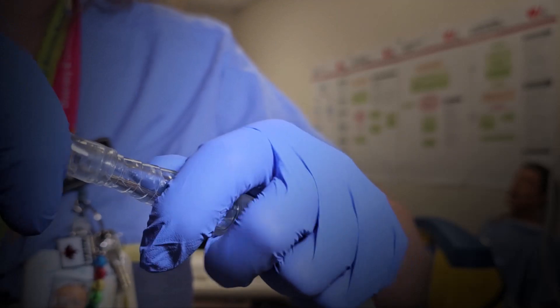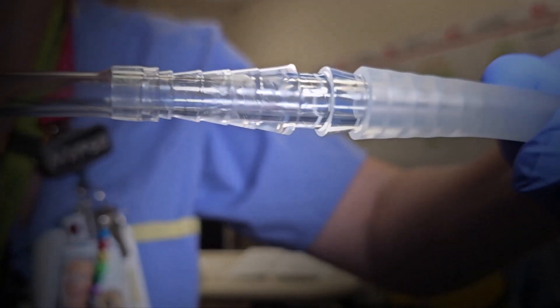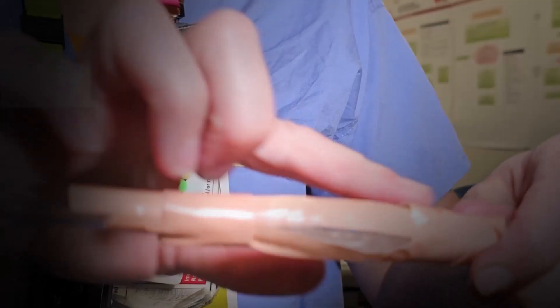Next, using aseptic technique, you're going to want to make sure that the chest tube connection is as tight as possible, and then you're going to want to further secure that tube using waterproof tape.